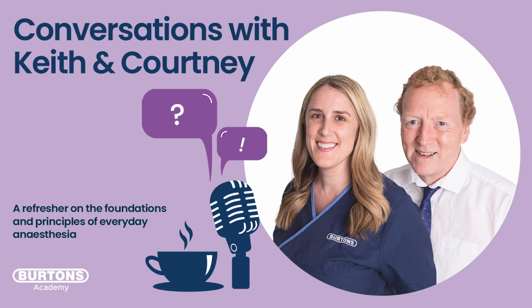expiring. That could be, I guess, a kinked tube, a bit of resistance there, or a bit of mucus in the ET tube. So just something in the way, or an asthmatic patient, something in the way of expiring that's adding extra resistance and changing the slope of our waveform. So we could use our waveform to get another idea of what's happening in our ET tube, or whether our breathing system's kinked. Maybe it's a dental procedure and suddenly the capnograph has changed the way it looks. So we could use that information. It's not just the number, really.